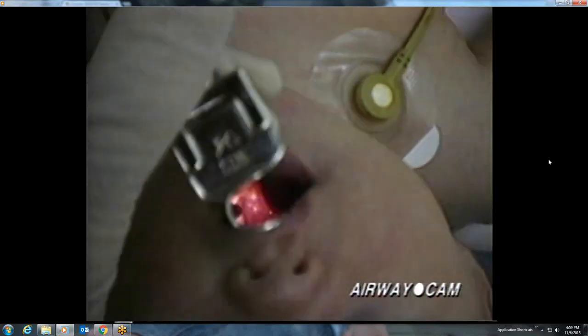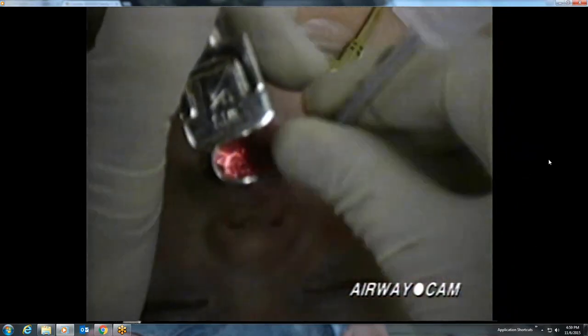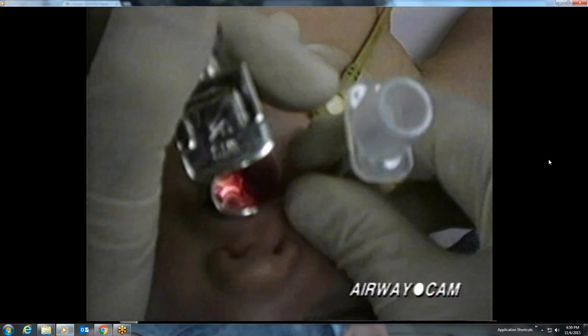Our final laryngoscopy is on a 1-month-old infant with a small Miller blade. Although the structures are much smaller, the fundamental technique is the same: tongue control, landmark identification, laryngeal exposure. A cuffless endotracheal tube is carefully inserted.